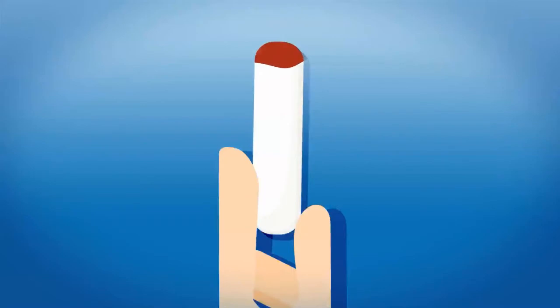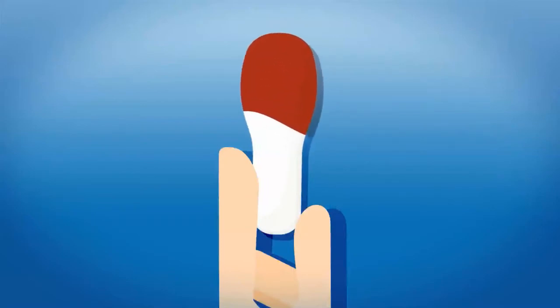Once the nasal plug is inserted, it softens like a sponge and rapidly expands to fit the nasal cavity, absorbing the blood.